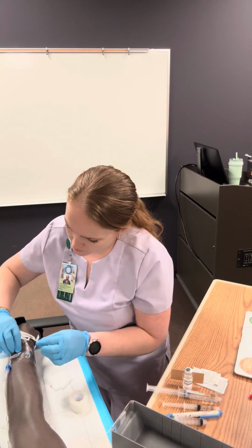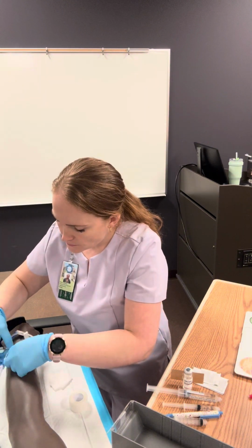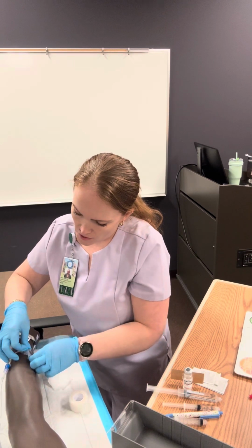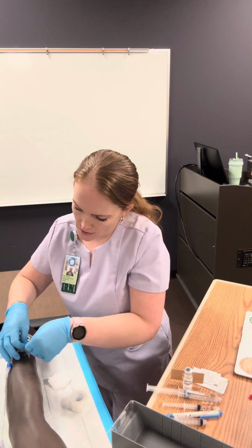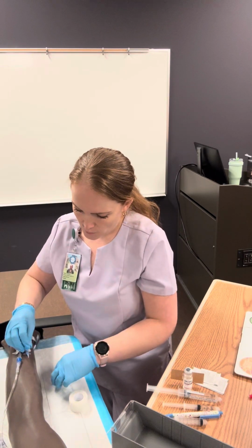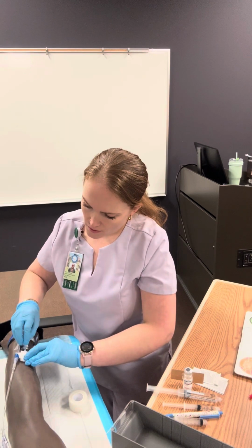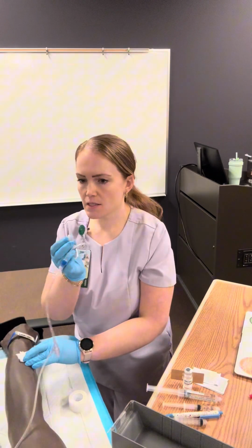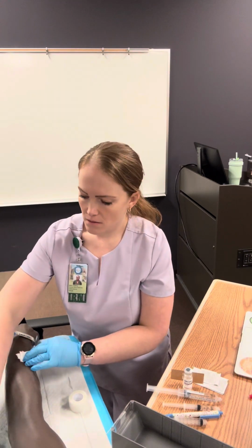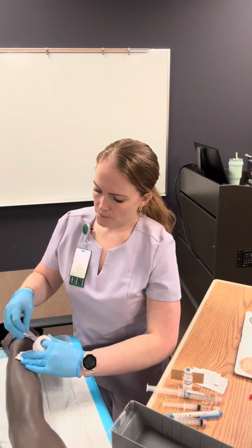And I'm going to carefully peel off this medication or this transparent dressing. Okay, I'm going to grab my gauze, place it on the site, pull this out, and I'm going to inspect this catheter and make sure that the tip is intact and prepare that for the proper disposal.